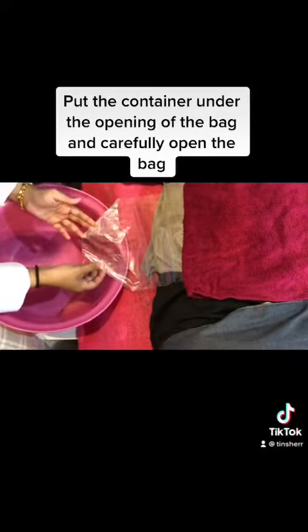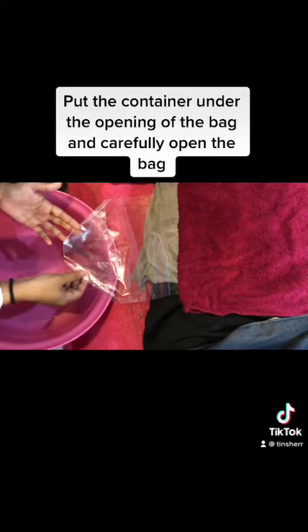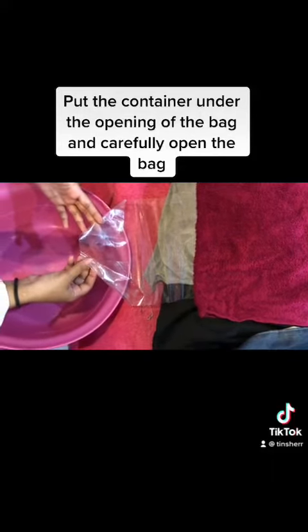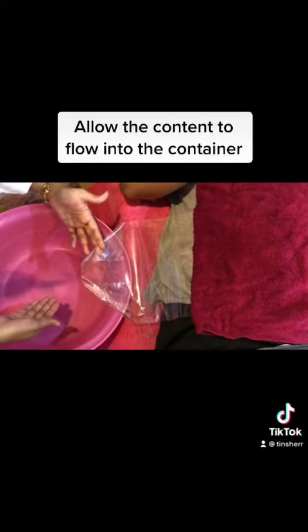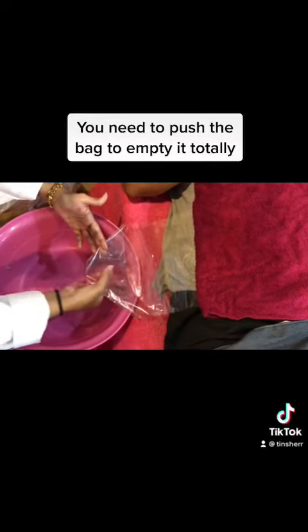So this is not a colostomy bag. This is a plastic bag because I don't have a colostomy bag with me. Usually, a colostomy bag has a clip at the open end of the bag. So carefully open the bag and then allow the content to flow into the container. You need to push the bag to empty it totally.